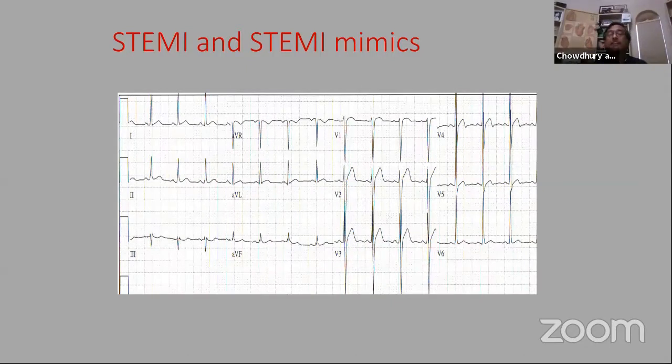But obviously this patient has LVH, right? So you have a lot of criteria, the Cornell criteria, the Romhilt-Estes criteria, Voltage criteria, all that. There is another criteria. Now that we do the EKG like this, I call it Ahsan criteria. This is the merging, this fusion. See that? When that happens, usually by the voltage criteria, however you calculate, it will be LVH. LVH-related ST segment elevation is very common, and I will show you an EKG later. LVH-related biphasic T wave, sometimes we call it Wellens, has low sensitivity and specificity.